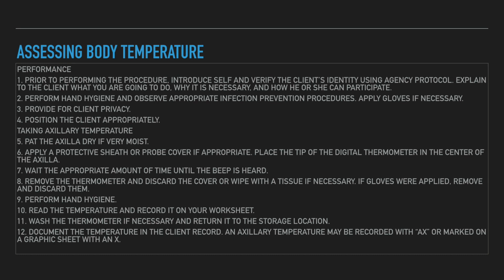Implementation. Check that all equipment is functioning. If necessary, shake a glass thermometer down to below 35 degrees Celsius. The indicator fluid will not fall below the starting level if the client's temperature is less than that. Beginning with the thermometer on a very low temperature allows the nurse to note that the indicator fluid has risen to the client's actual temperature.